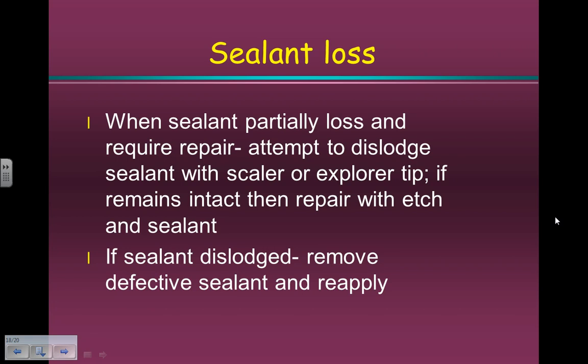Once again, the sealant will cover the occlusal surface with a thickness of 0.3 of a millimeter onto the cusp ridges. We don't apply the sealant as just a thin painting in the pits and fissures. That thin amount of sealant will be lost prematurely.